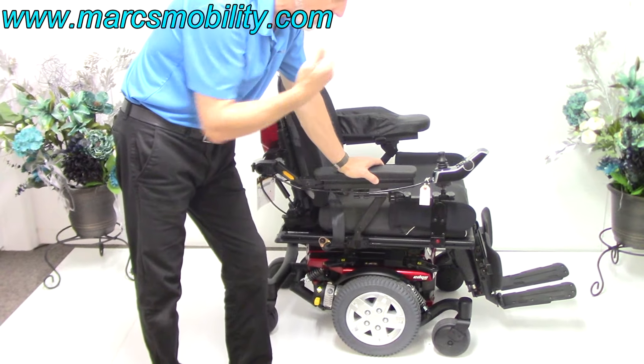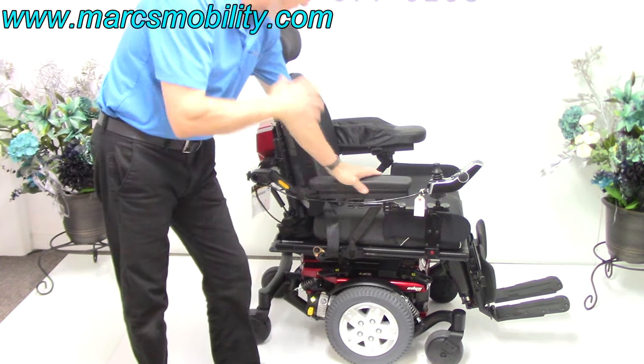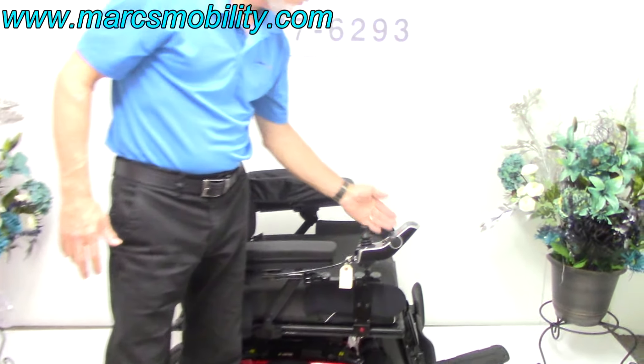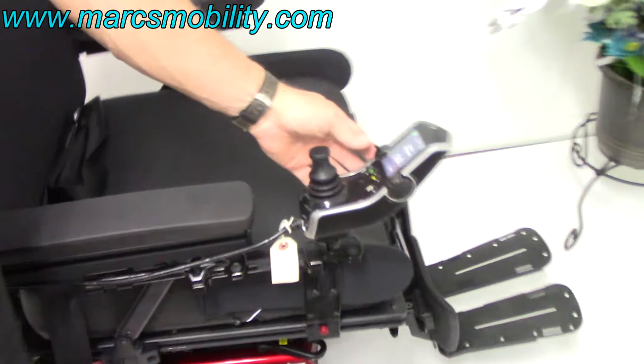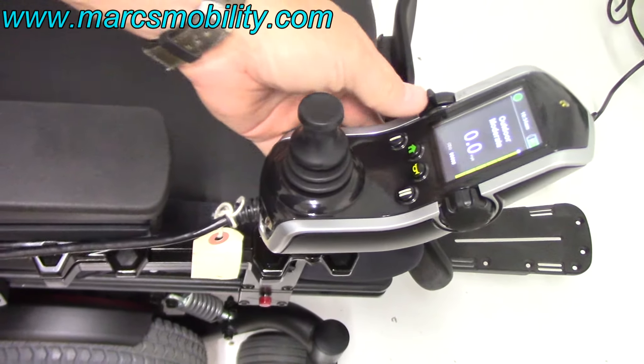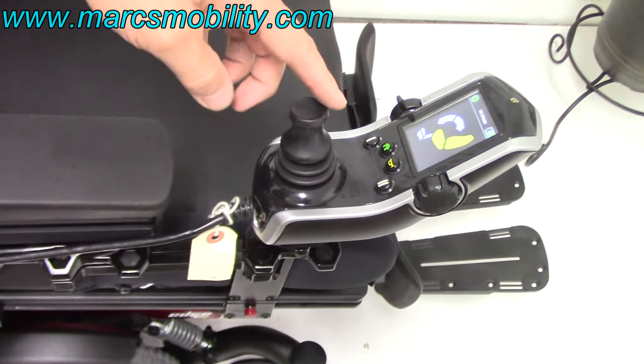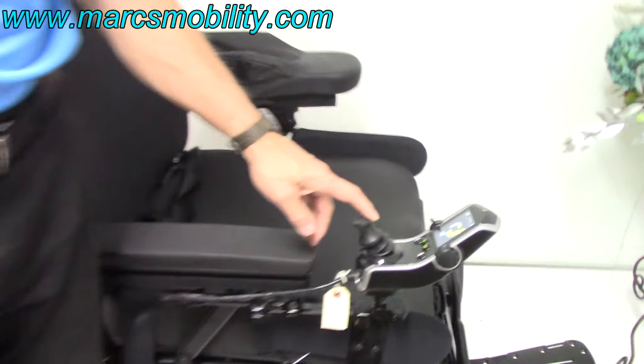It has other features which we'll cover in a minute. To make the seat go back, you work everything through the joystick. Keep pushing the button on the left until you get a picture on your screen of the chair you're in. For tilt, pull the joystick back once you see the tilt icon.